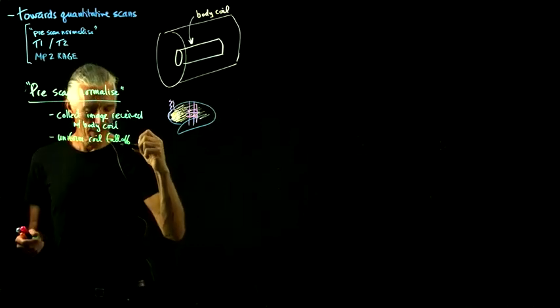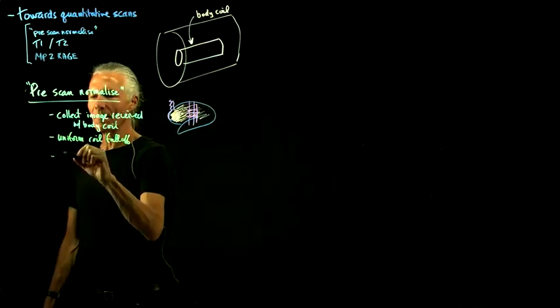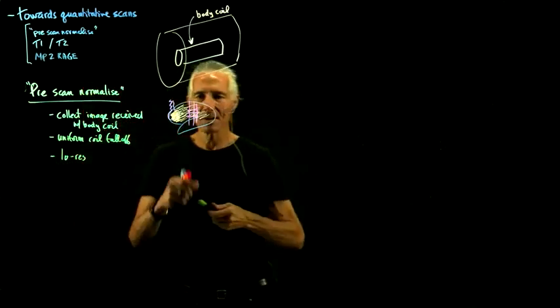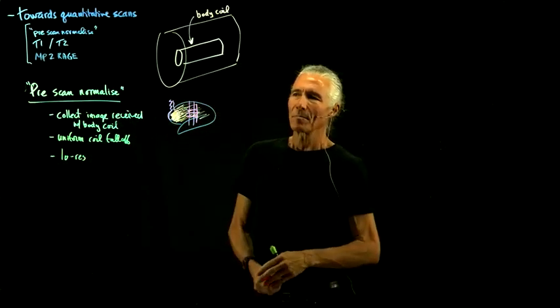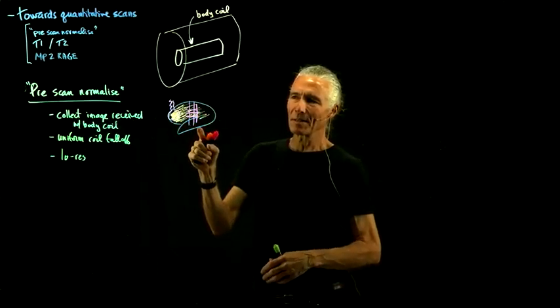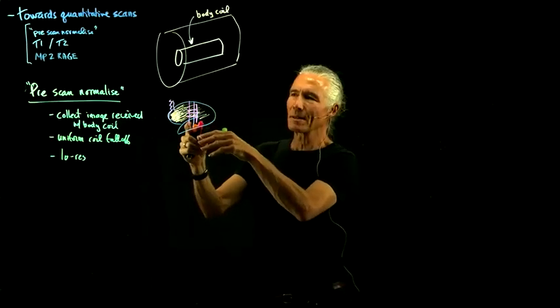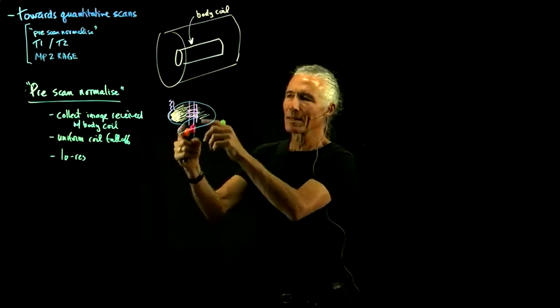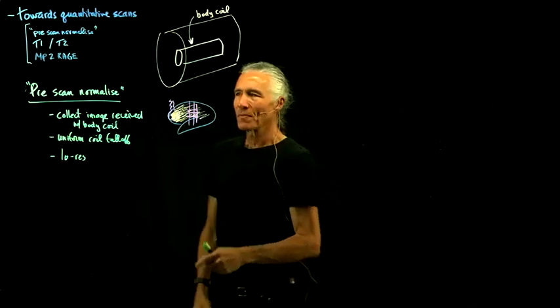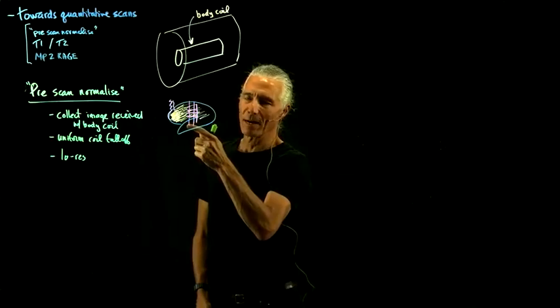And then you just go ahead and collect your regular scan. So it doesn't have to be very high res. And then now we've got the same object but recorded with these brightness varying scans. And so you can see there's various kinds of hacks you could do, like smooth the actual image that you get out about the same smoothness as this one, and then try to divide by this image, especially if it doesn't have very much gray-white contrast.